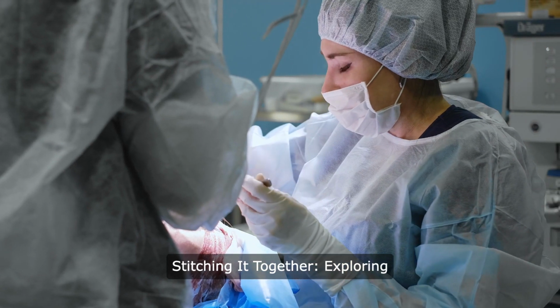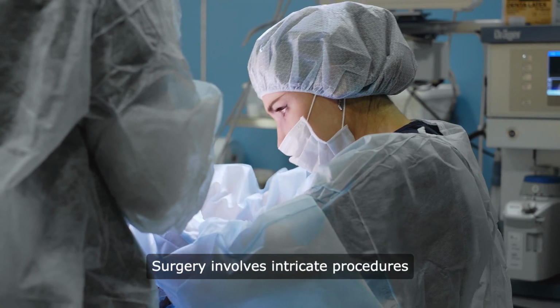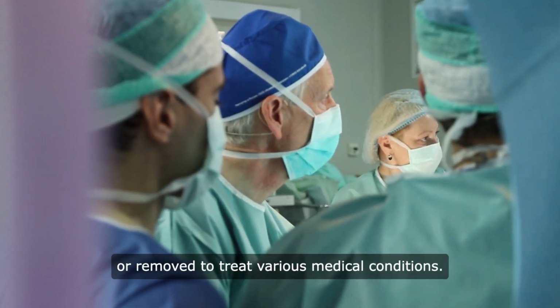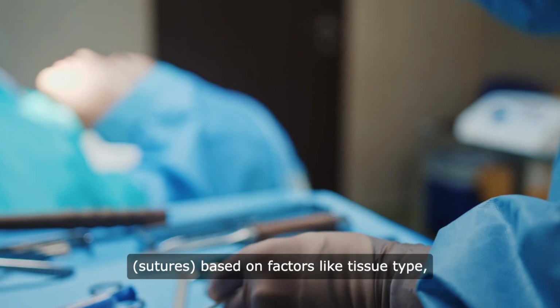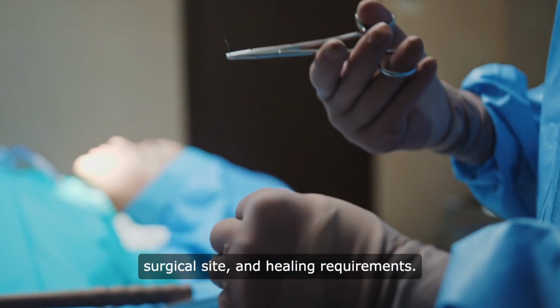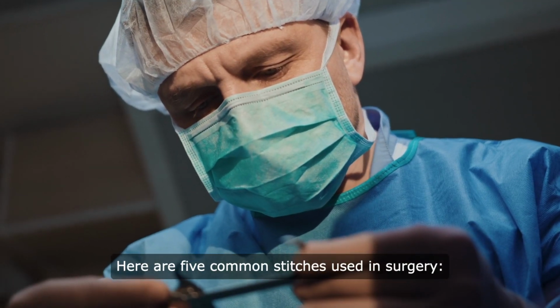Stitching it together, exploring 5 common surgical sutures. Surgery involves intricate procedures where tissues are manipulated, repaired, or removed to treat various medical conditions. Surgeons employ different types of stitches, sutures, based on factors like tissue type, surgical site, and healing requirements. Here are 5 common stitches used in surgery.